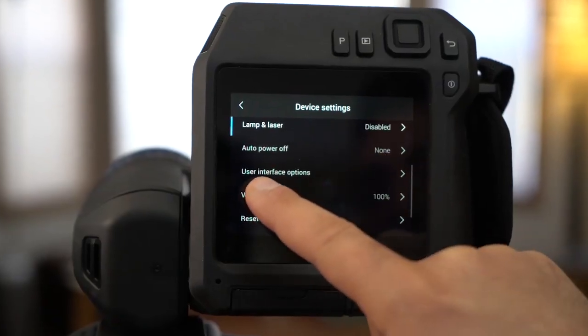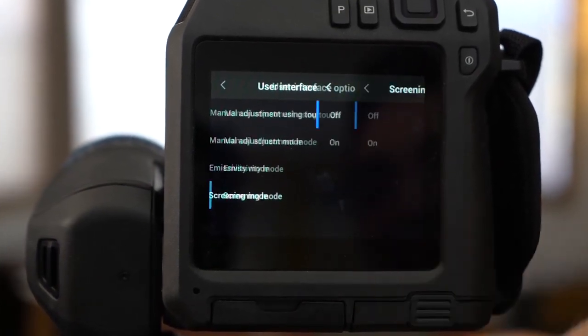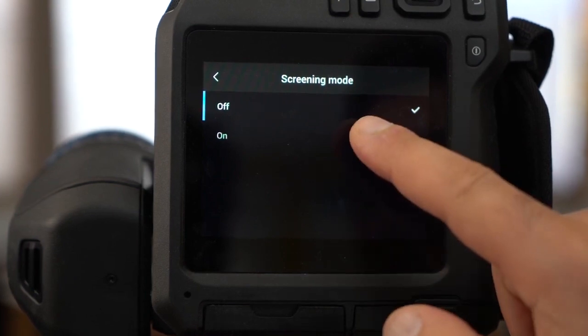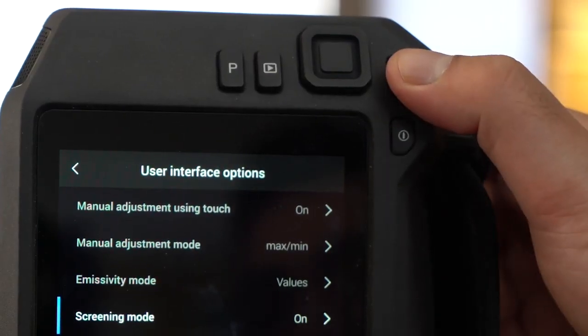Next, scroll to user interface options and tap to enter the menu. Now, select screening mode. Enable the screening mode by tapping on. Click the back button to exit settings.